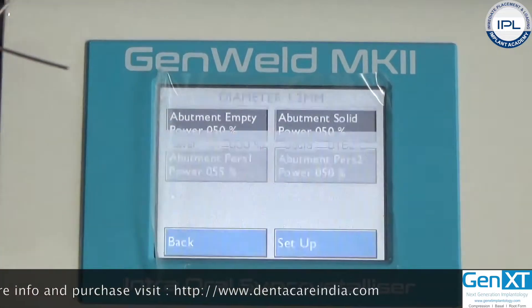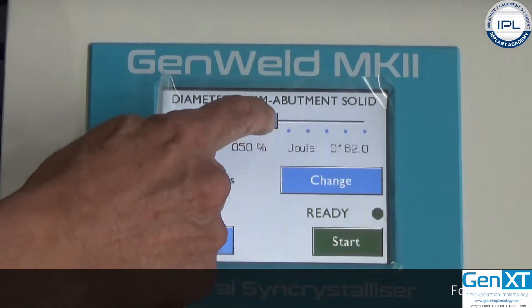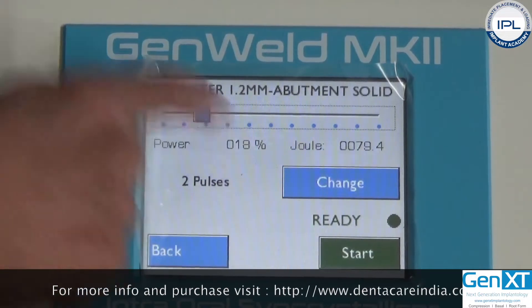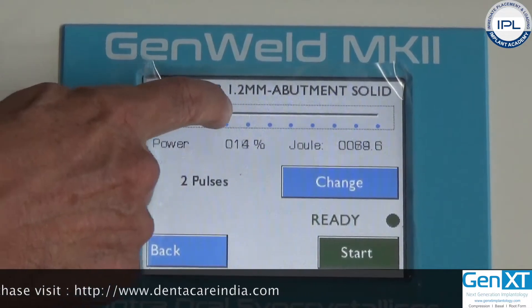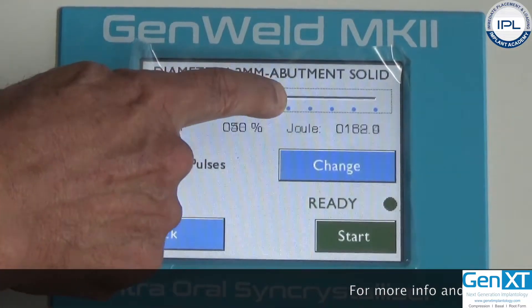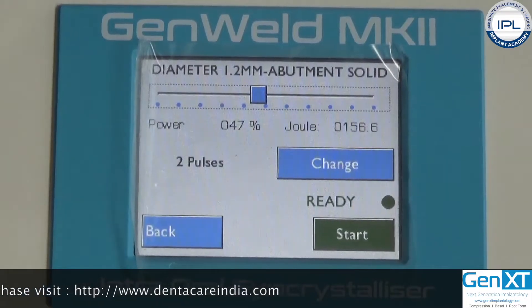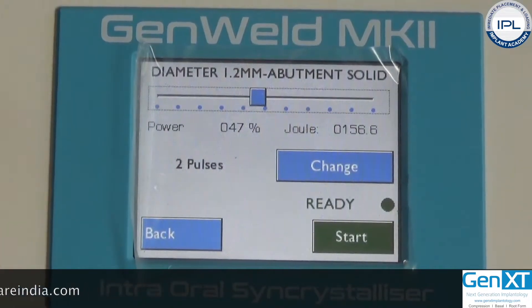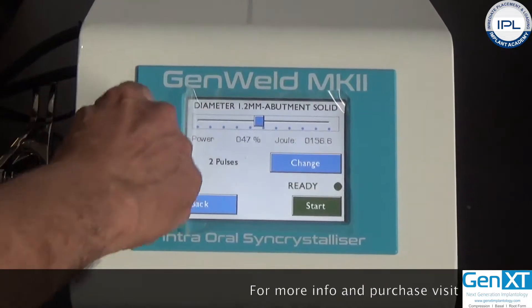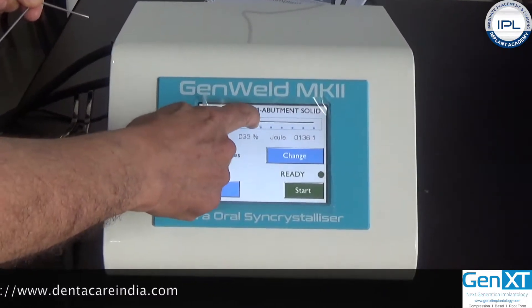With abutment solid selected, you see a bar that you can move left to reduce the energy level or right to increase it. The factory setting comes to around 50 percent, so let us keep it there. When you are welding, if your expectations are met or not, you can change the energy levels for each diameter. We now have diameter 1.2, abutment solid, set.